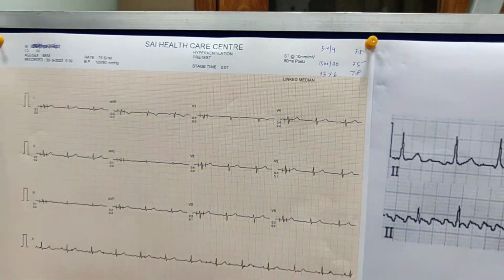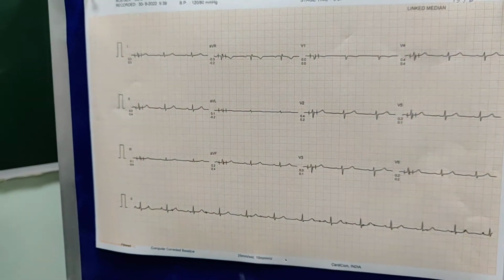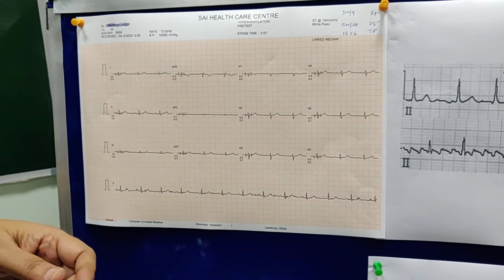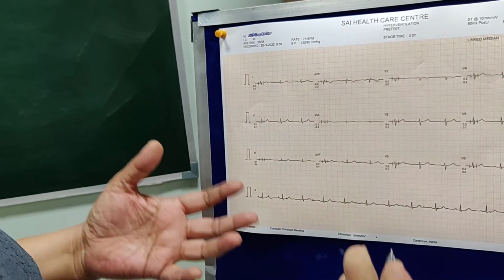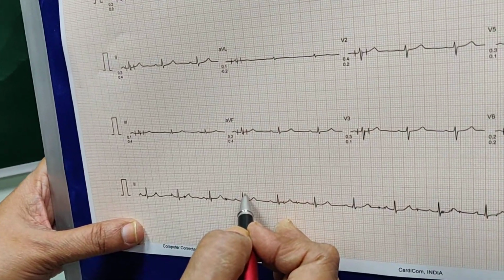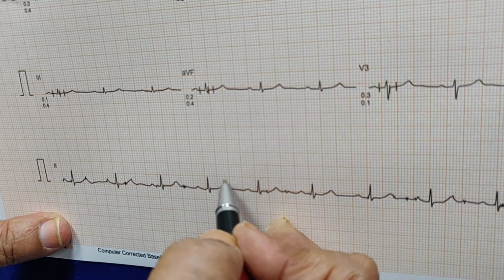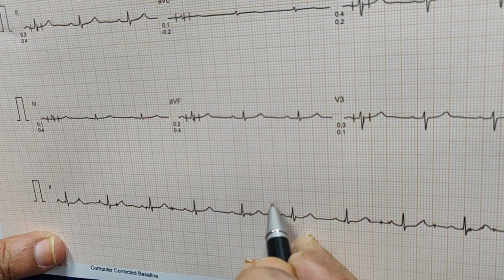So for me in clinical practice, I just do this 1, 2, 3, 4, 5, 6 like that. And there is also one more thing. I think it is good for those who understand Hindi language, because I have crammed this: the first large box will be 300, 150, 150, 100, 100, 75, 75, theek hai? So 300, 150, 100, 75, 60, 50, 43, 37.